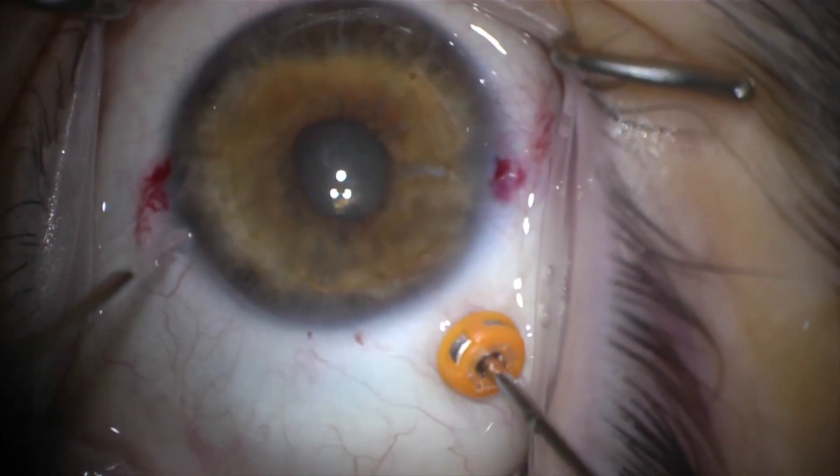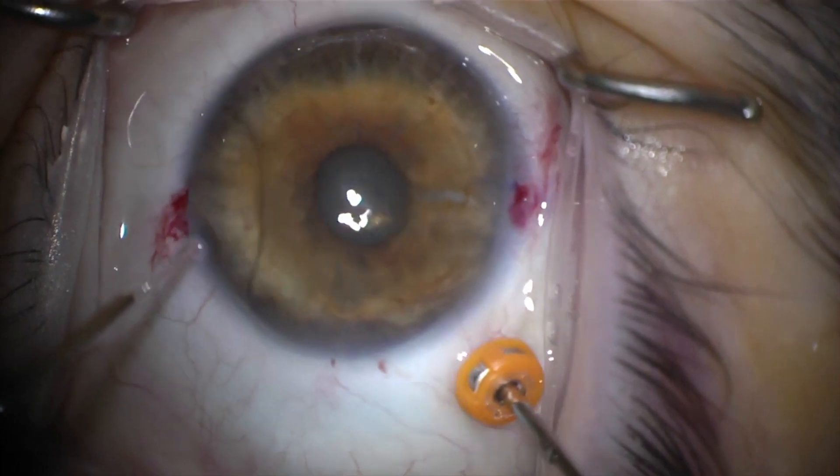The endpoint for vitrectomy is slight deepening of the anterior chamber and infolding of the cornea. Now the anterior chamber can be deepened, and the surgeon can proceed with phacoemulsification.